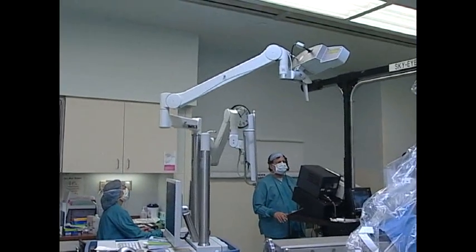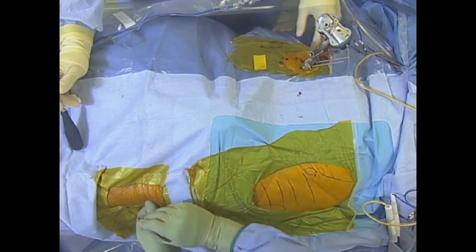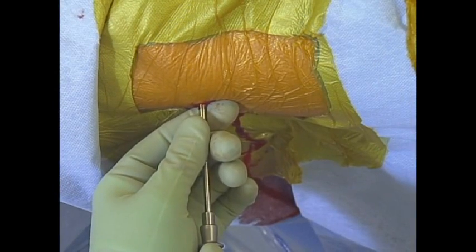The camera is at the end of the arch and we can see it quite well. For leg length, we make a little poke hole on the distal femur, then use this drill — we only bury the tip, not the drill — and that gives us a little hard stop to create a small divot.